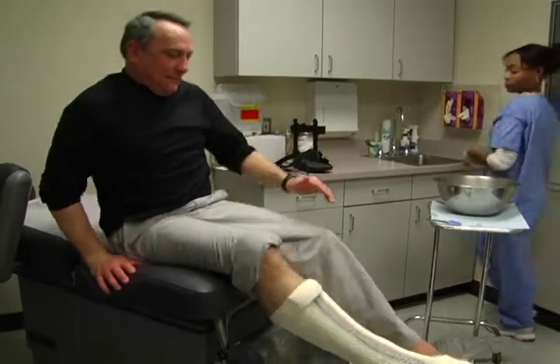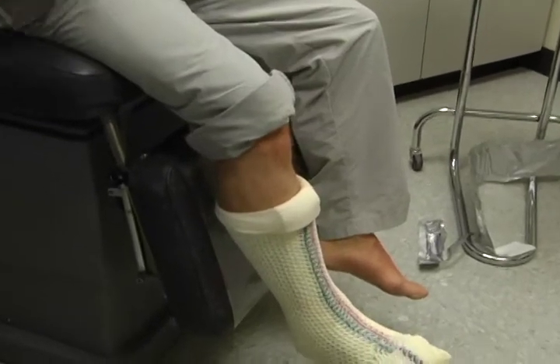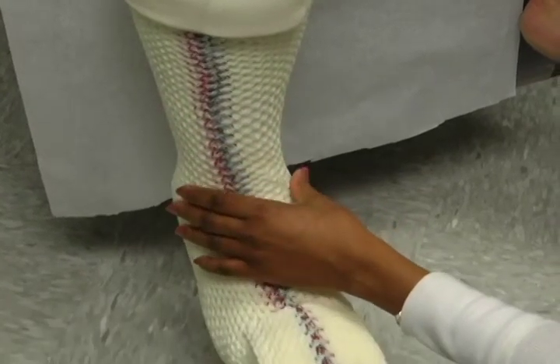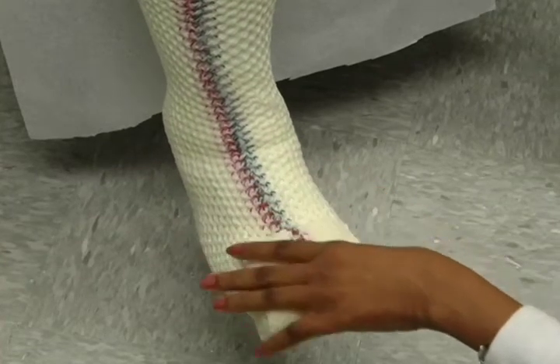Step 8. Dry time. The patient can now be returned to a seated position with the cast suspended over the edge of the chair. Allow the cast to dry for approximately 15 minutes or until the toe area of the cast is cool and hardened. With the design of the TCC EZ cast, it is normal and expected to have flex in the cast after it is fully cured.